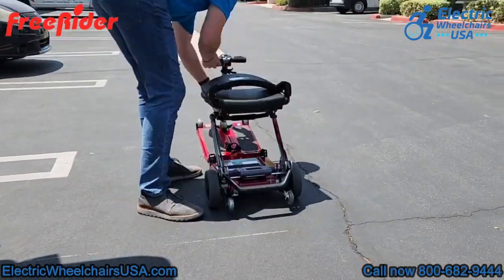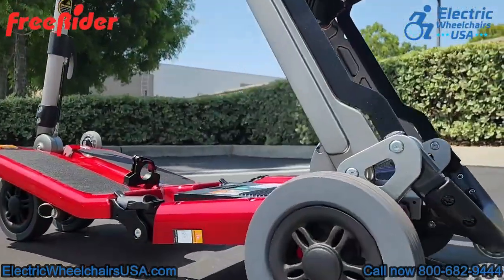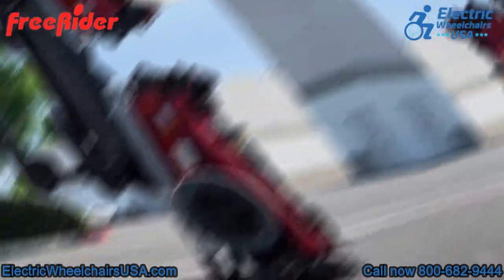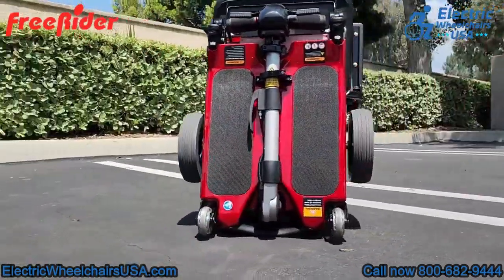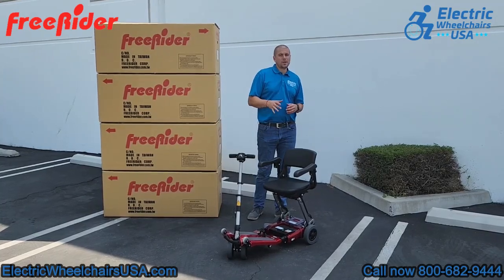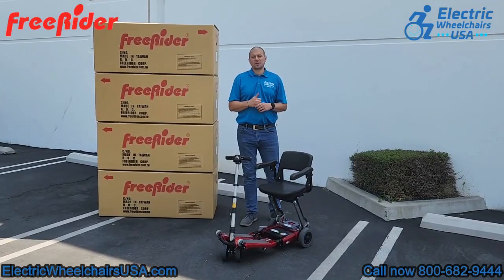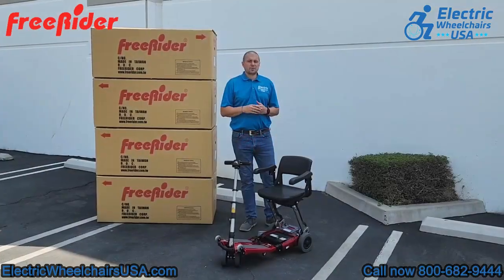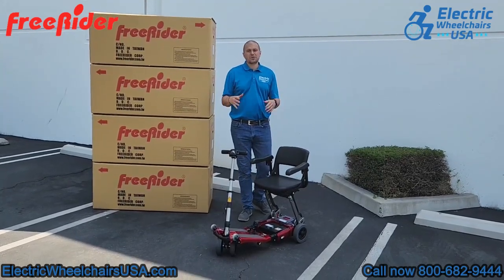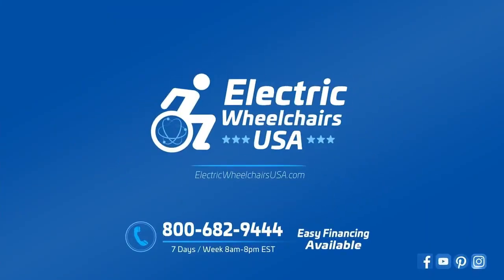The Luggy Elite, like all the Luggy scooters, is great for transporting — easy to put in the back of a vehicle, all airline approved, and really well made. If you're looking for a folding mobility scooter that can support a higher weight capacity up to 320 pounds, the Luggy Elite is a great choice. It's made by Freerider, who has been around for over 30 years. If you have any questions, feel free to call us at 1-800-682-9444 or visit us at electricwheelchairsusa.com.